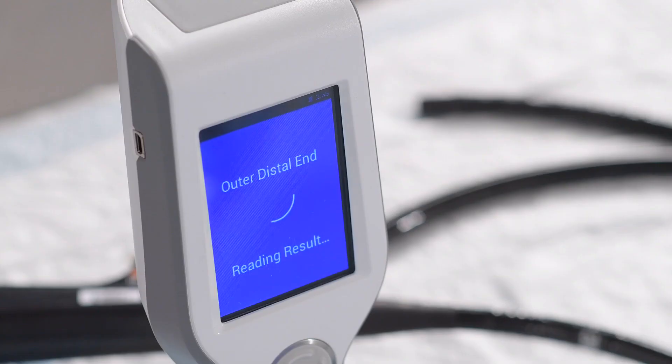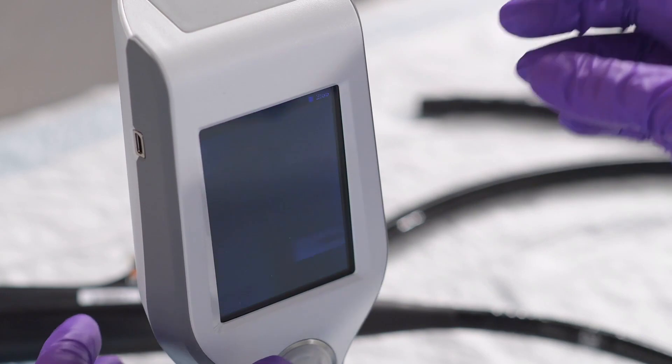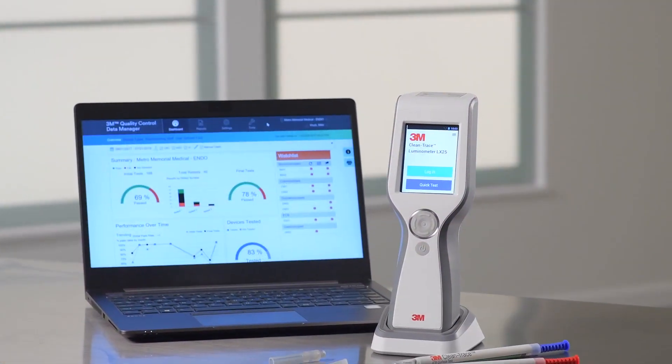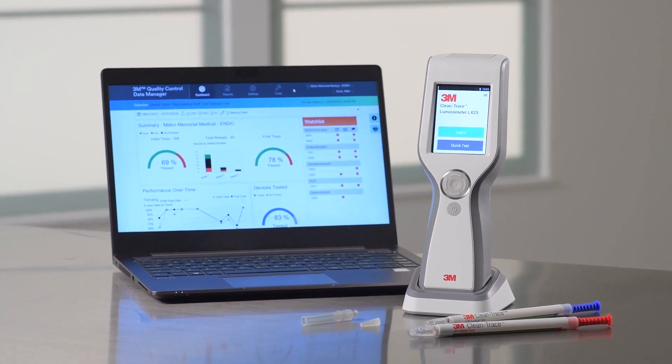In 10 seconds or less, you'll see the result, a quantitative RLU value and a pass or fail response. With the 3M CleanTrace ATP Monitoring System, you get immediate, accurate results.